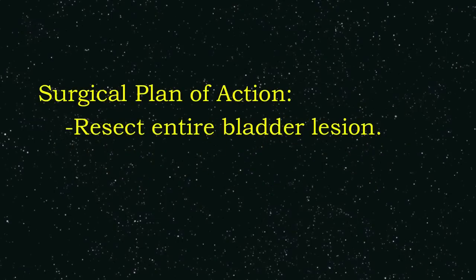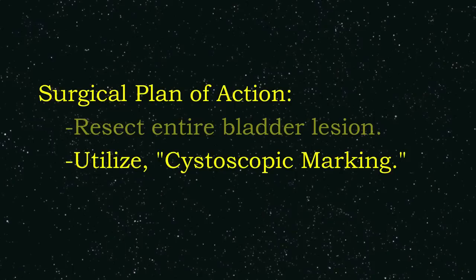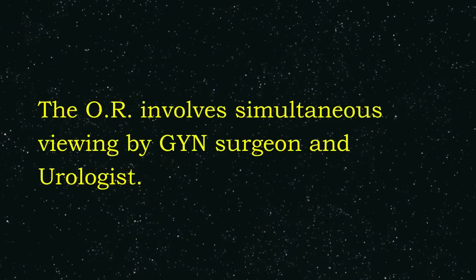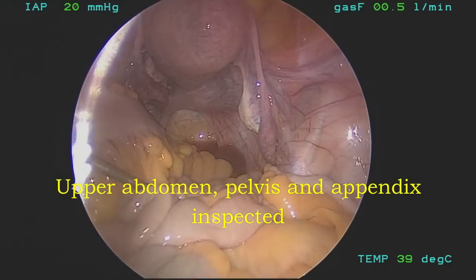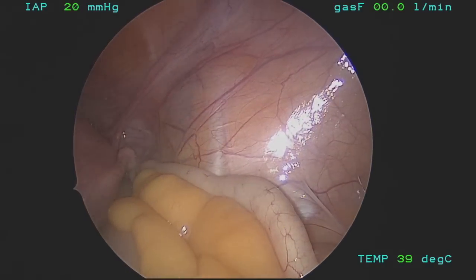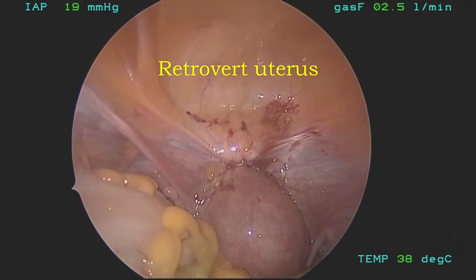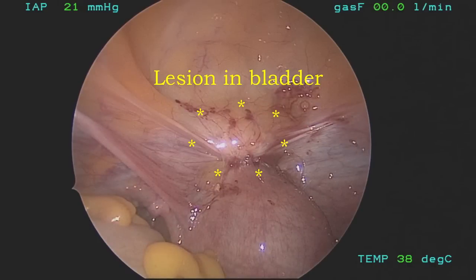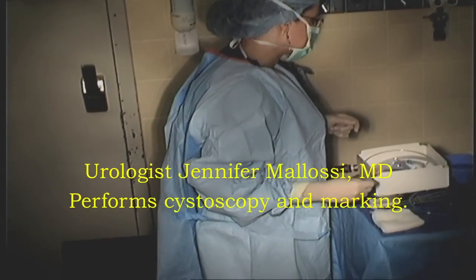This includes resecting the entire bladder lesion, utilizing cystoscopic marking, and repairing the bladder and draining the bladder for 10 days. In the operating room, we use 2 video systems, one for the surgeon and one for the urologist. The pelvis and upper abdomen is inspected, as well as the appendix. The uterus is sharply retroverted, and the lesion is clearly seen here involving the bladder and the lower uterine segment.